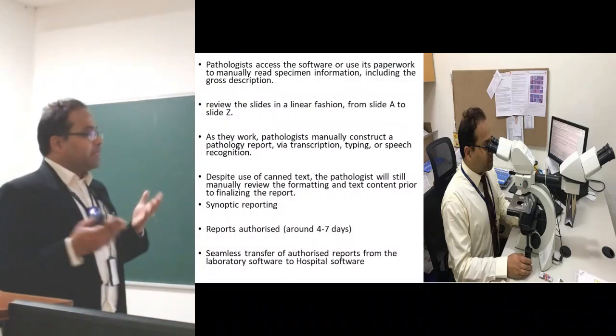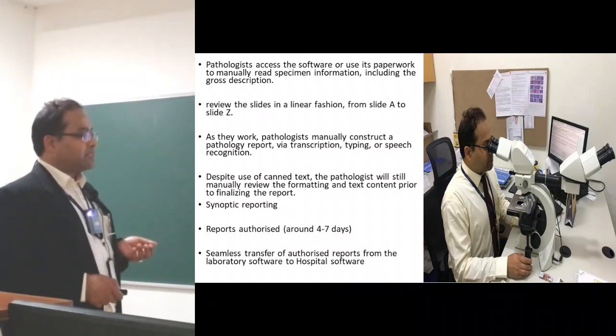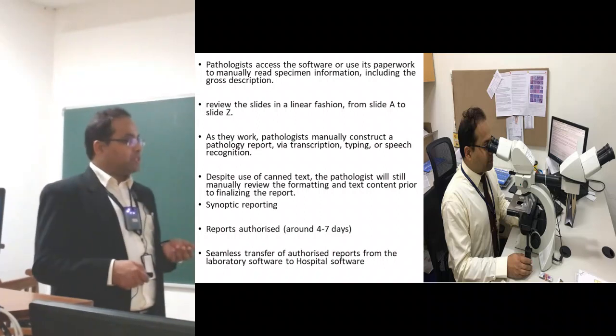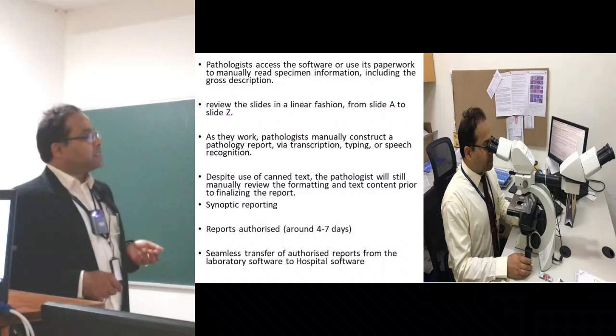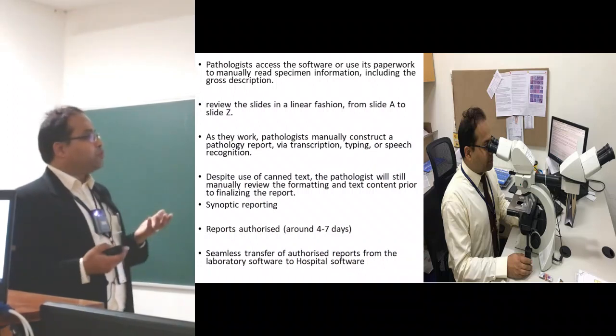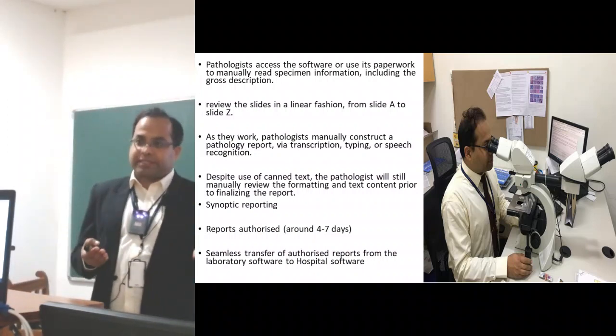When the slides come to us, this is my workstation at the Tata Medical Center. We have this microscope, which is a double header, in which we have fellows for teaching, and then there's the computer system. The pathologist, which is me, will access the software and try to get all the information that has already been stored in the system.